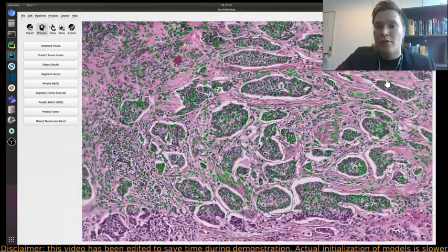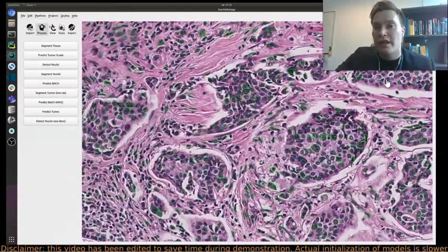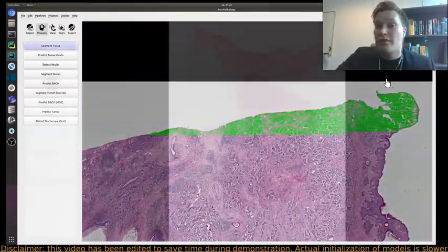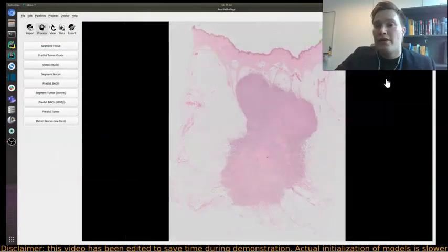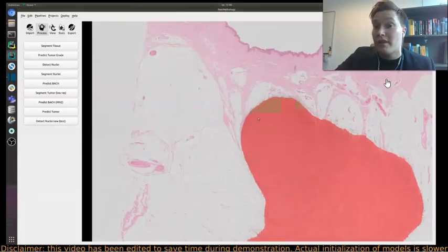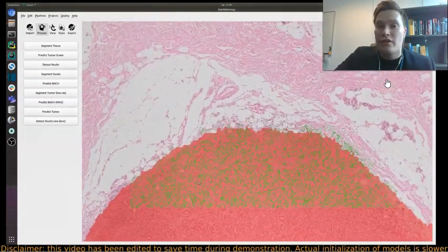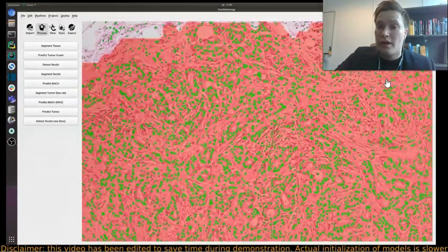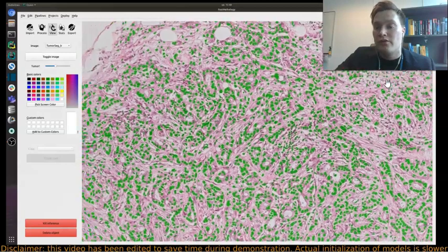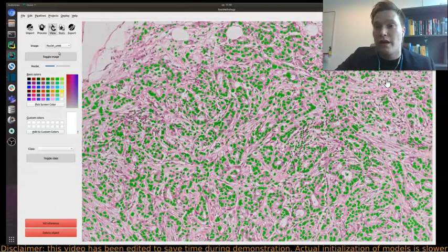And now as I zoom in, you will actually see the bounding boxes much more clearly, as you couldn't see before, because we were compressing the textures quite a bit. And here is another example of me doing a similar analysis, but this time I'm doing higher resolution semantic segmentation of nuclei. And as you can see, this is also possible and working quite well. Here I'm changing which results to show, and here I'm showing with and without the nuclei.